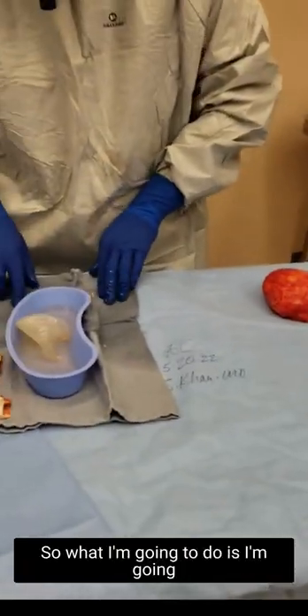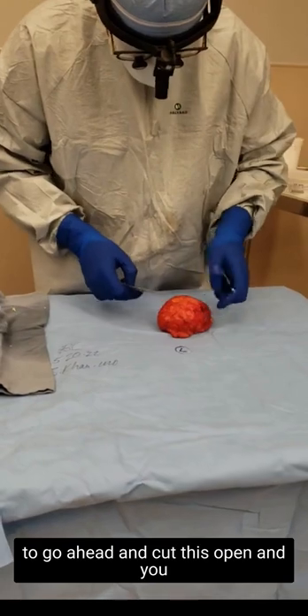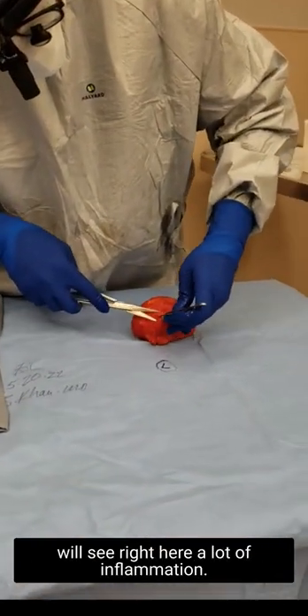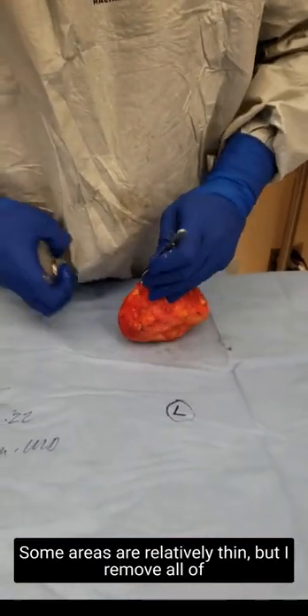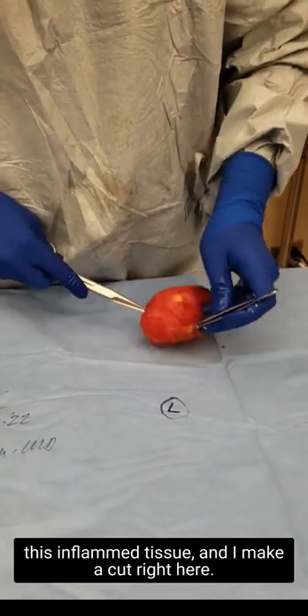What I'm going to do is go ahead and cut this open, and you will see right here a lot of inflammation — some areas relatively thin — but I remove all of this inflammed tissue.